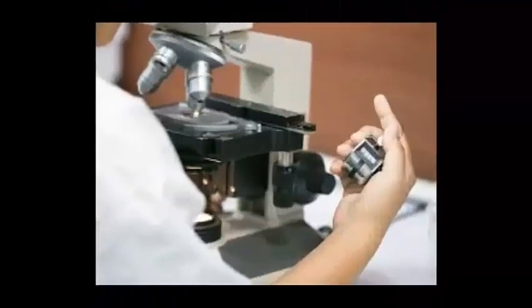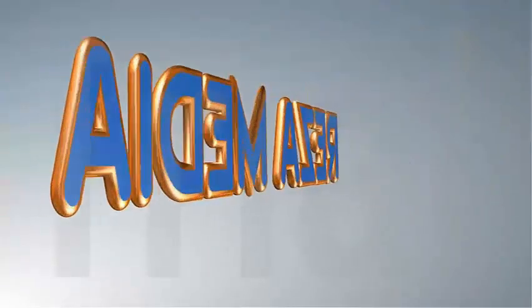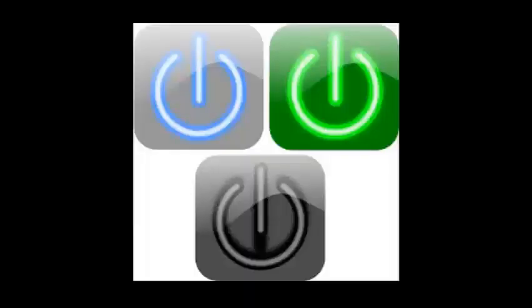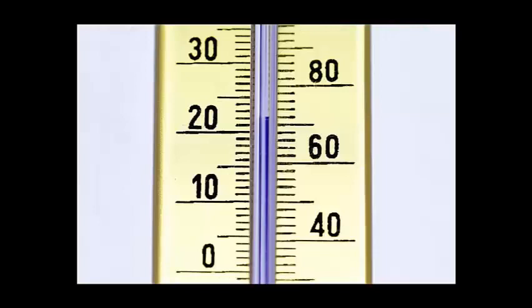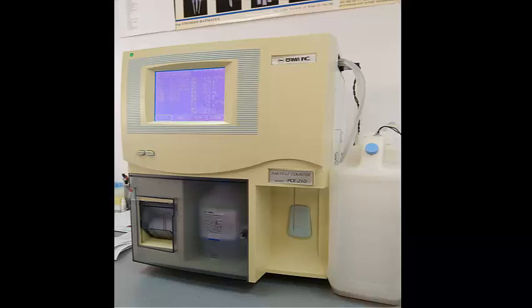All users of cell counters should consider the principles that lead to the operation of the device, and some of them are below. Observe things such as turning the device on and off, checking pressure levels according to the device type, maintaining and washing daily, weekly, and monthly, necessary repairs, replacement of solutions, and other actions in accordance with the manufacturer's instructions.